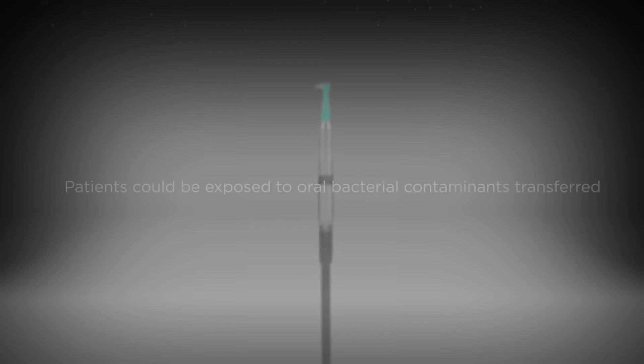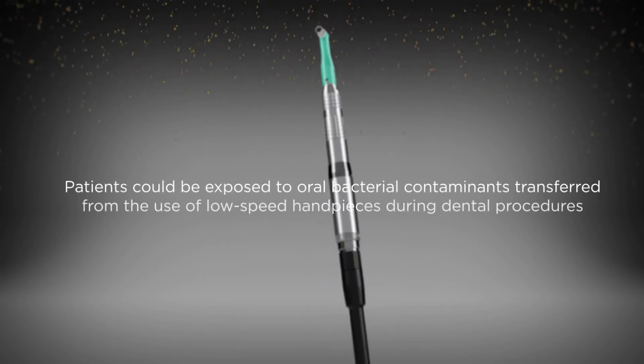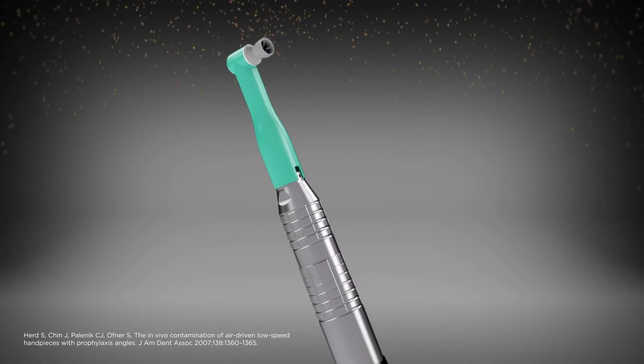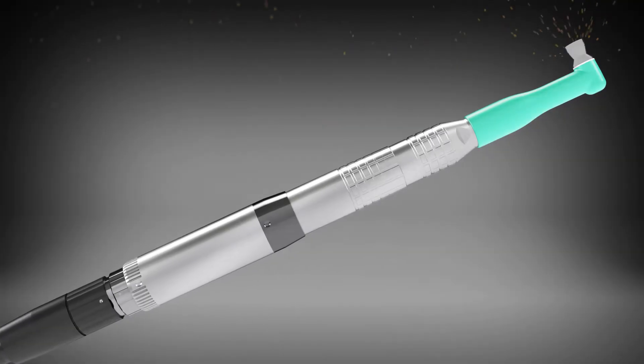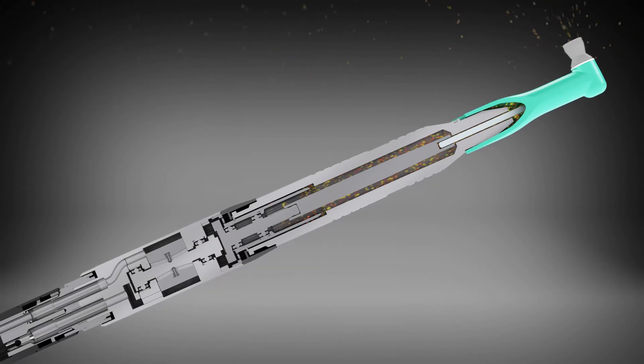Patients could be exposed to oral bacterial contaminants transferred from the use of low-speed handpieces during dental procedures, and studies have shown the internal surfaces of those dental handpieces connected to air lines can become contaminated with patient fluids during use. Air-driven handpieces require external venting, which provides access for this cross-contamination.